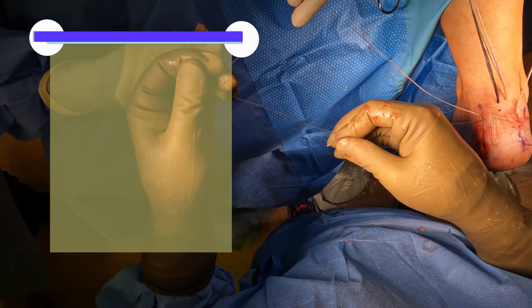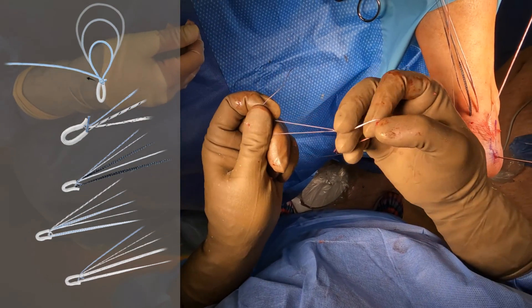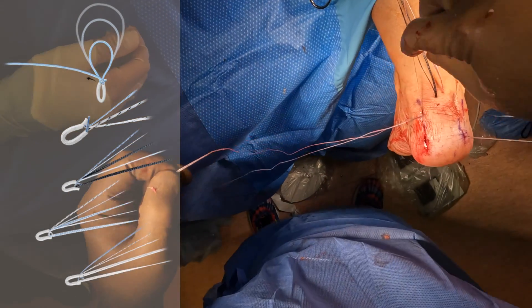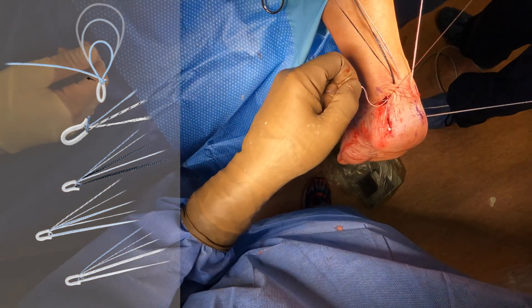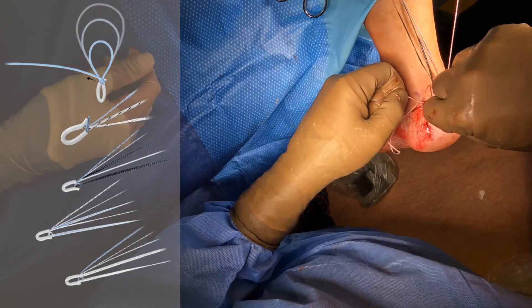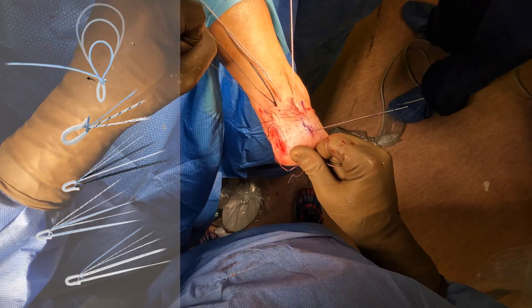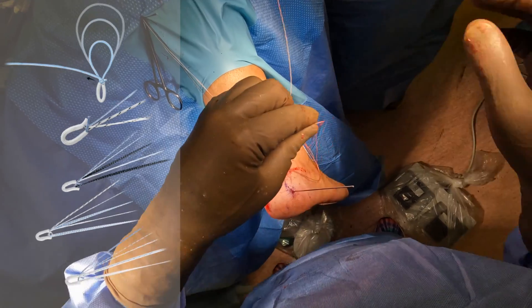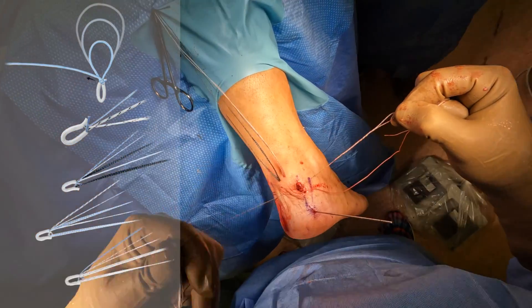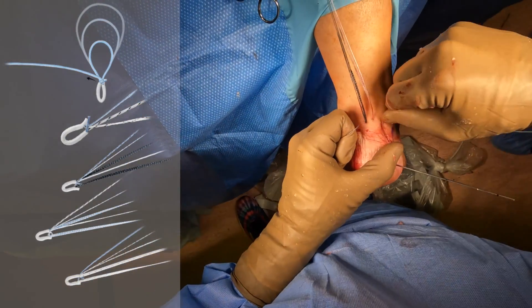After that's done, we're going to take our lasso that has a mark on it, pulling it down through the hole of our fiber tack. We're grabbing the fiber tack on the end, using our lasso to then pull that knotless fiber tack through. It's going to go down through that loop that was inserted into the calcaneus, and there it's being set. So now we have a knotless fiber tack that's pulling one portion of the Achilles against the heel bone. Now we're doing that same exact process from the lateral side, using that lasso to grab our knotless fiber tack, pulling that fiber wire through and pulling it on the outside of the Achilles tendon but on the inside of the skin — so it's between the skin and the Achilles tendon.